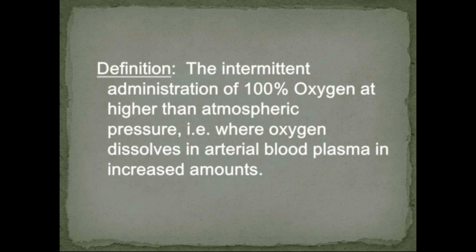So what is the definition? Hyperbaric oxygen means intermittent administration of 100% oxygen at higher than the atmospheric pressure. That is, where oxygen dissolves in arterial blood plasma in increased amounts.